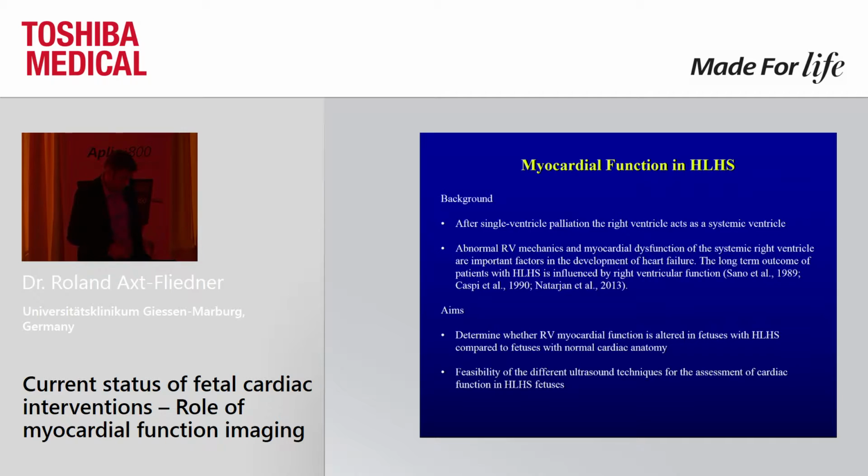So we try to elaborate, by the advanced techniques of myocardial imaging with the Toshiba machines, how we could depict differences among different forms of hypoplastic left hearts.